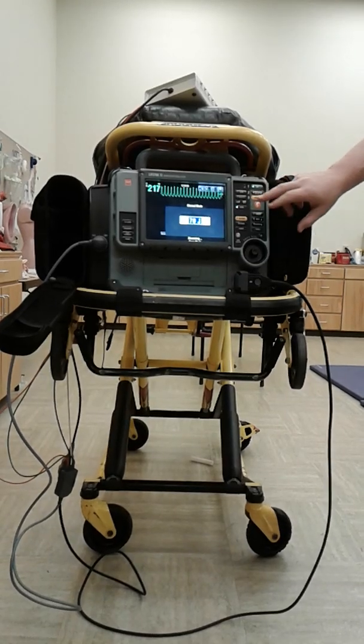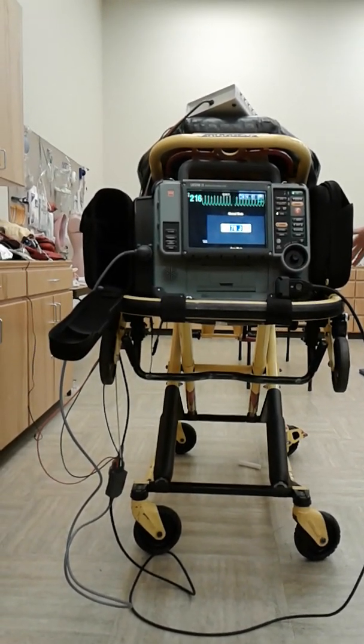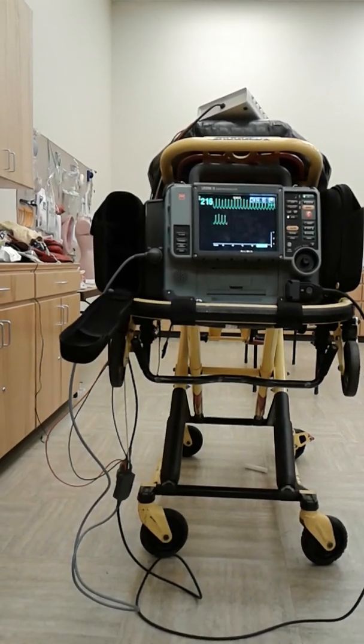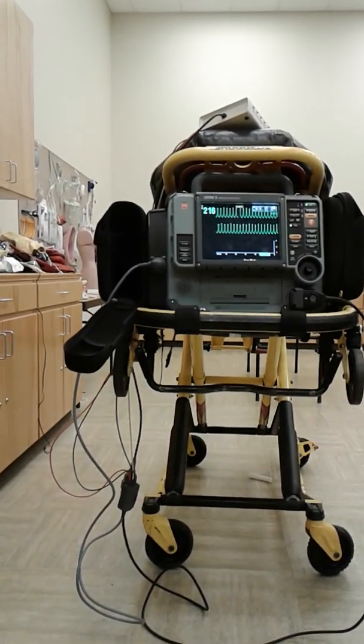SVT is one of those rhythms that, for your treatment, you should have a strip of paper behind it, because that way you can justify why you did what you did. And now with the electronic charting and all, you really don't have to, because it kind of rolls over in there from the monitor for you, but you always want a paper trail for anything you do.